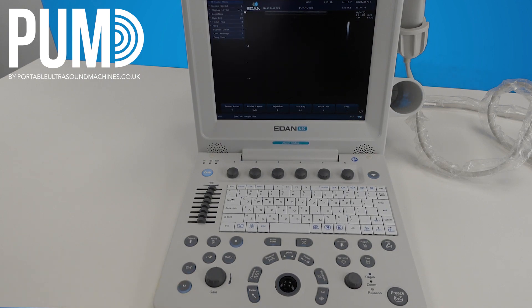CW works the same, and M mode is similar. Hit M mode — that will bring up your cursor. You can adjust the cursor to make sure it's in line with what you want to watch. At the bottom you will see your trace.